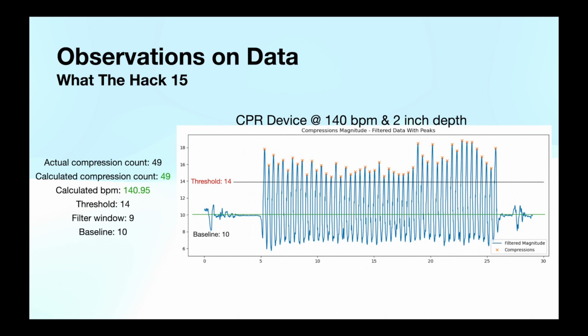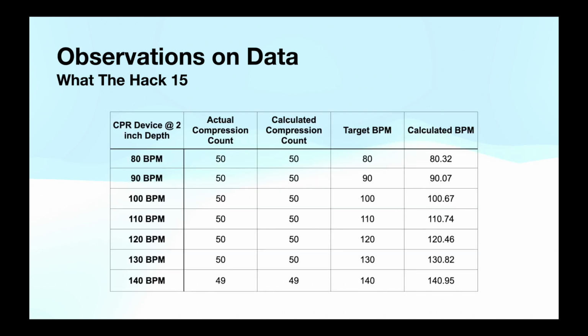As can be seen here, this has worked well so far for accurately tracking compression count and average compression rates across the data that has been gathered. We will continue to gather data and test our compression count and rate calculating methods for accuracy.